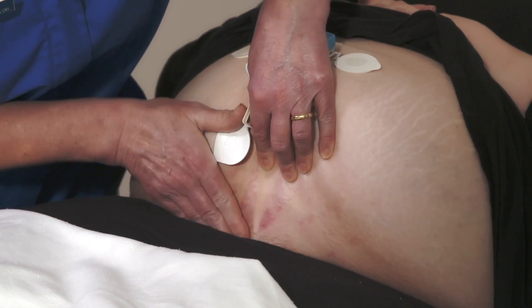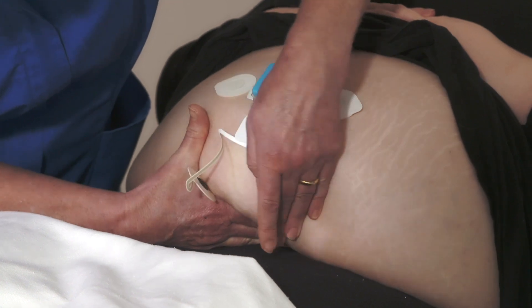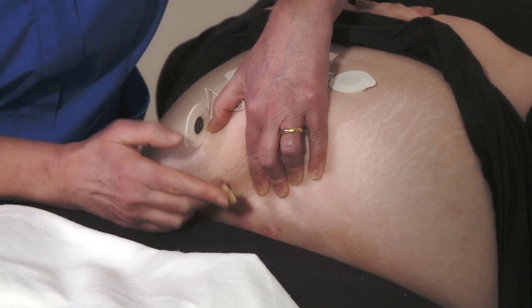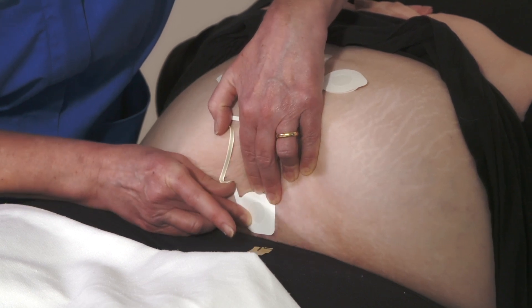The lower electrode on the flexible tail, as we showed earlier, should be placed on the top of the panus, 6 centimeters above the estimated symphysis pubis location on top of the panus. An alternative is to reposition the electrode lower down on the abdomen, placing it under the panus just below the fold.